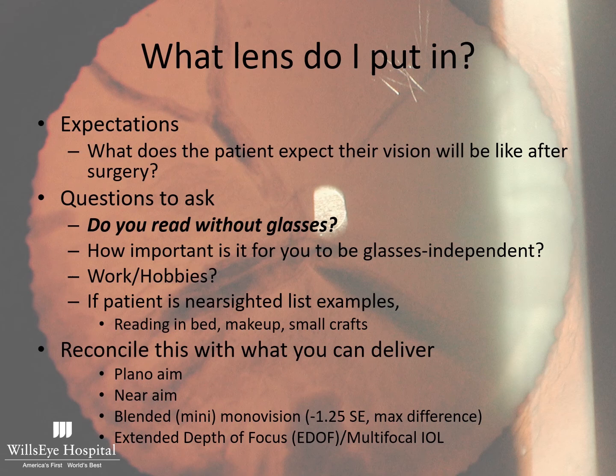Now, do you do a plano aim? Do you do a near aim? Do you do a version of blended or mini monovision? Studies have demonstrated that there's a good preservation of depth perception with less than 1 1/4 diopter spherical equivalent difference, although some patients can be more sensitive. If a patient's done monovision in contacts, this is a slam dunk. Just recreate that with cataract surgery. Or you can consider multifocal, trifocal, extended depth of focus lenses.